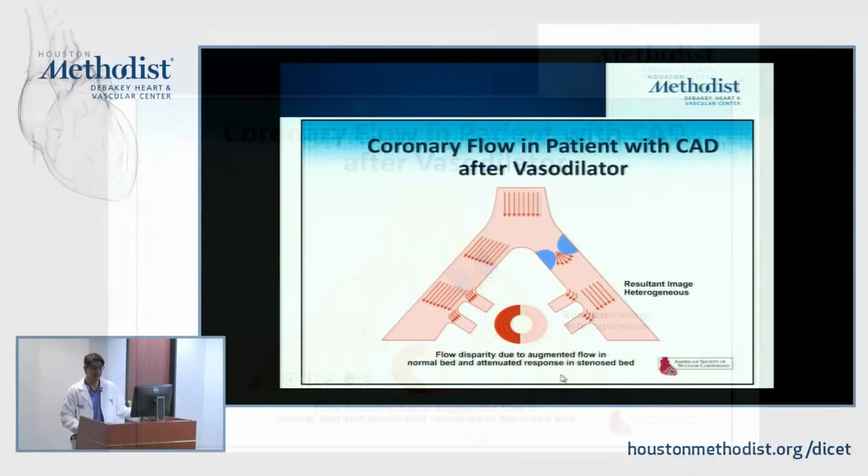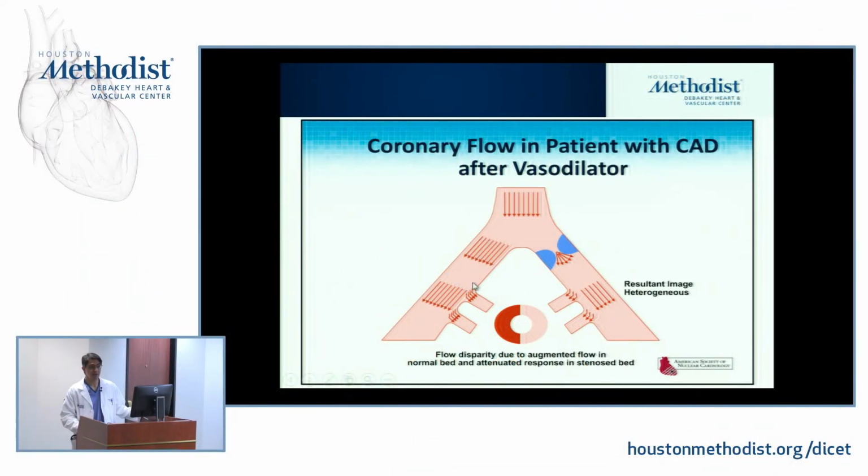So when you look at these images, this flow disparity will translate into different radiotracer uptake, and as you evaluate the images, you will then be able to see a hypoperfused area from a normally perfused area.